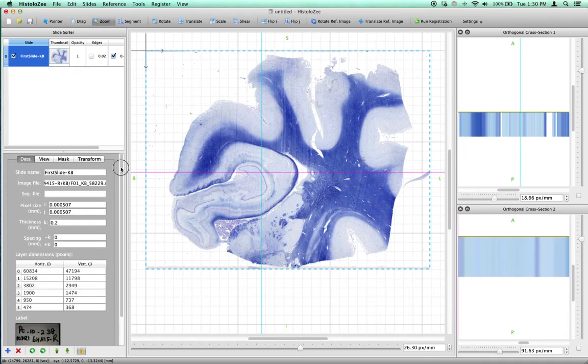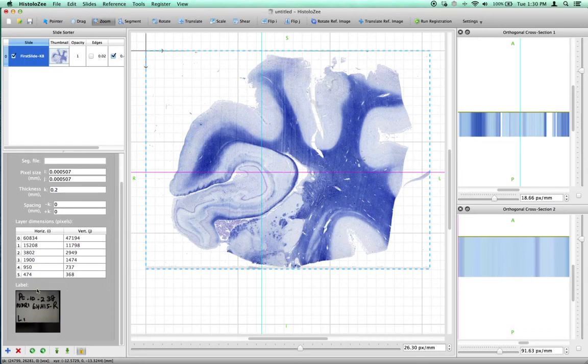So we've learned about the Data tab. One last thing on it is this label figure, which is taken directly out of the Aperio SVS image. Most commercial slide scanning software appends a small label image to each slide just to show you any notes that were taken on it, including sample ID, slice number, etc.